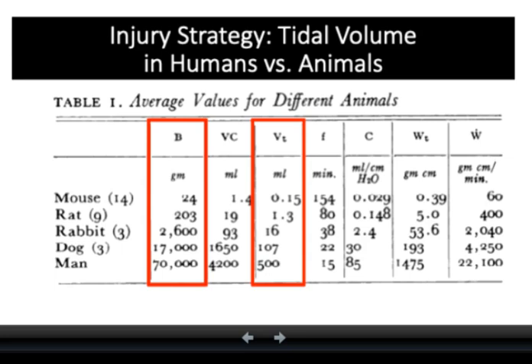These types of studies were the reason why the ARDSNet network or group of researchers chose 6 mL per kg as an intervention in the study group as compared with 12 mL per kg in a control group.